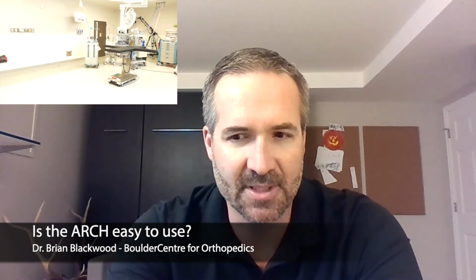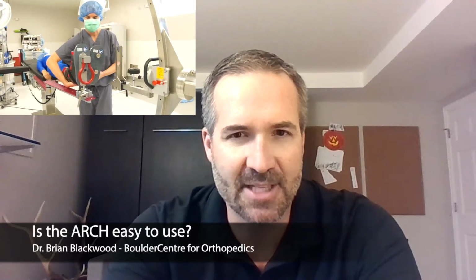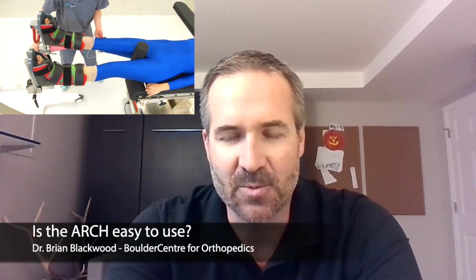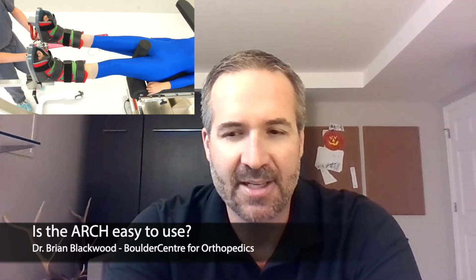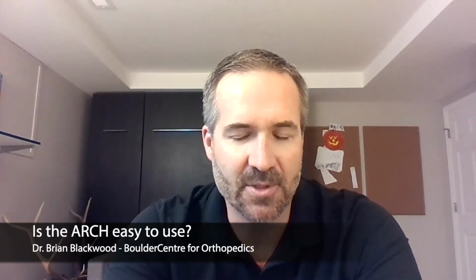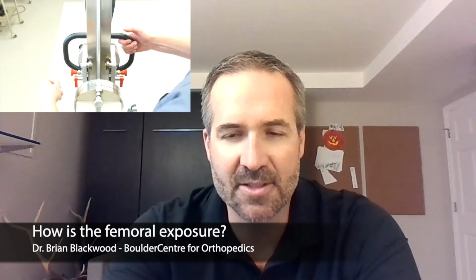We're doing 2 rooms, and as we bounce back and forth between knees and hips, the staff is able to set up the table very easily in the hip room. They're able to get the patient positioned. I just have to walk in and sort of fine tune the positioning. And then the staff is very comfortable running the table and responding to the positions that I want, using those objective numbers for external rotation, abduction, how far we're dropping the leg, how much traction we're putting on the leg when that time occurs. I think we get excellent femoral exposure with the arch table.